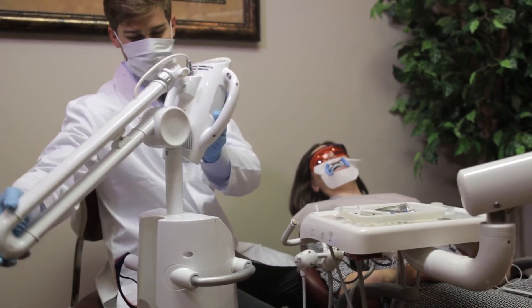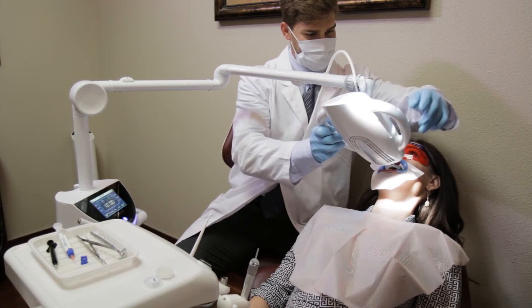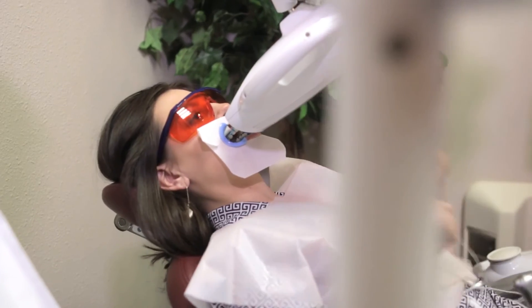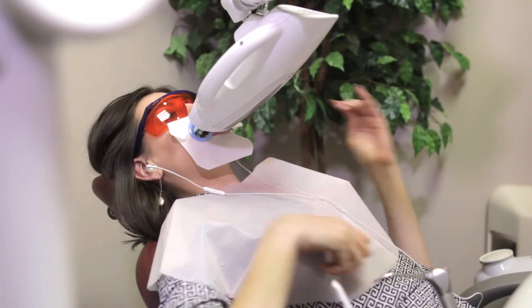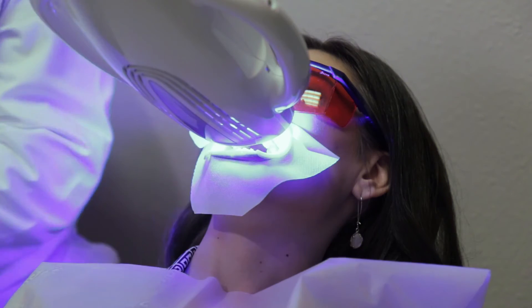Raise the lamp arm and position the lamp head as close as possible to the surface of the teeth, with the lamp head at a 90 degree angle to the teeth. Provide the patient with music or entertainment during the treatment. Once the lamp head is positioned, press the start button to begin the first cycle.